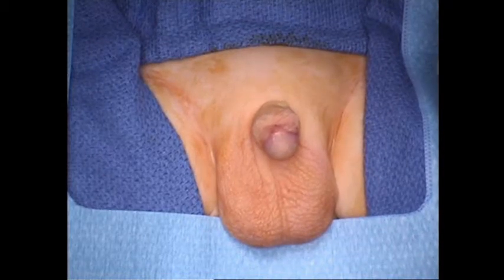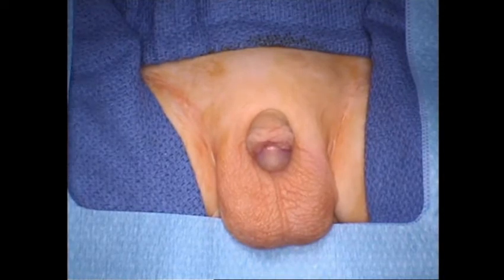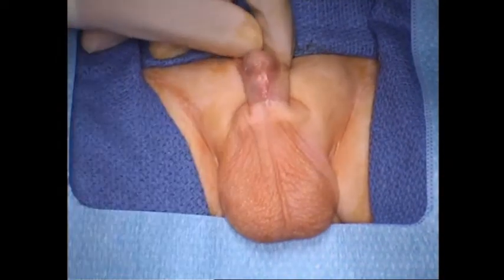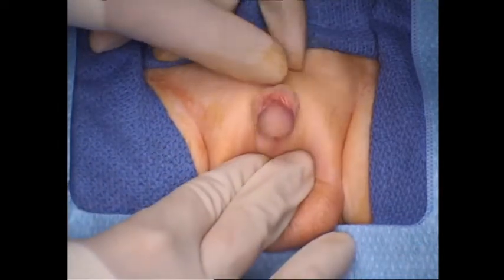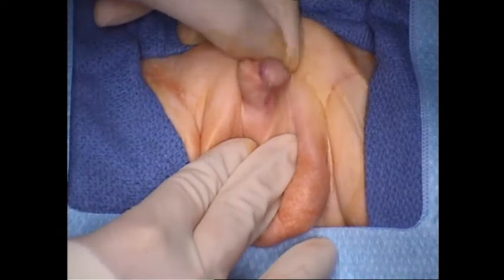Digital capture recording. Hi, it's Dr. Bush and Dr. Snodgrass with PARC Urology, and we have a patient here with a penoscrotal meatus, what looks like some ventral curvature. I'll try to show you from the side view here.